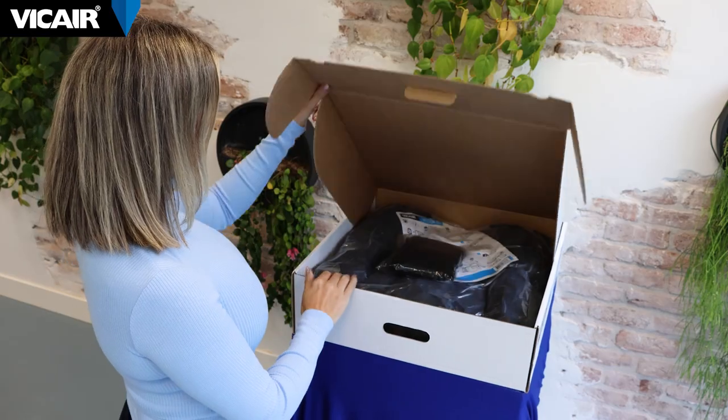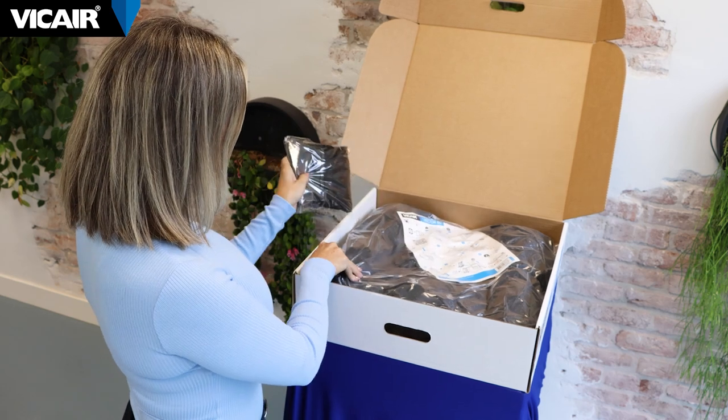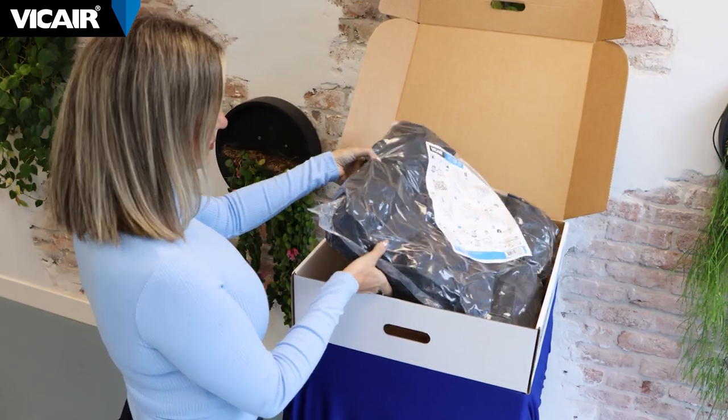On the box, there is a label that indicates the size and which vCare cushion model is inside. The cushion cover is sealed separately, and every cushion is sealed together with a quick installation guide with a QR code to the manual.